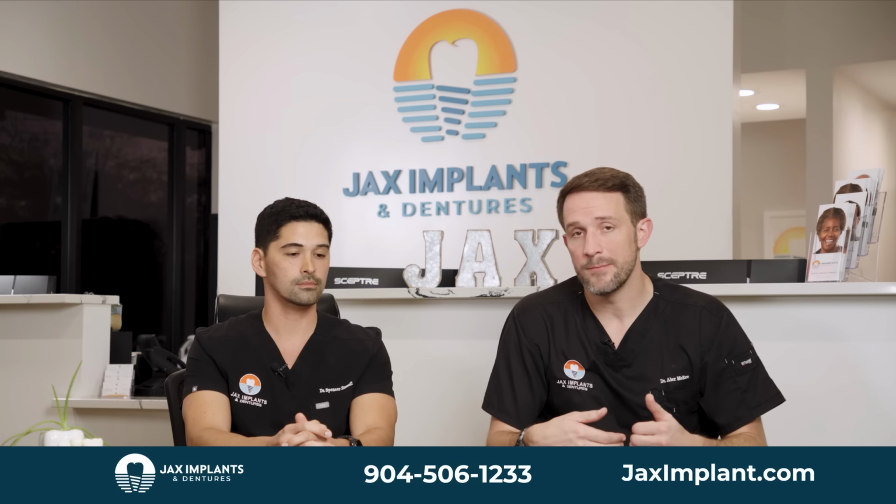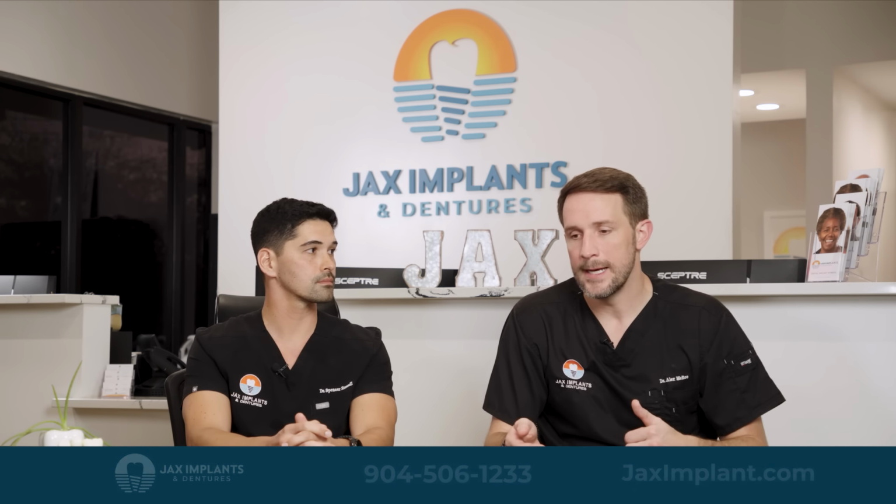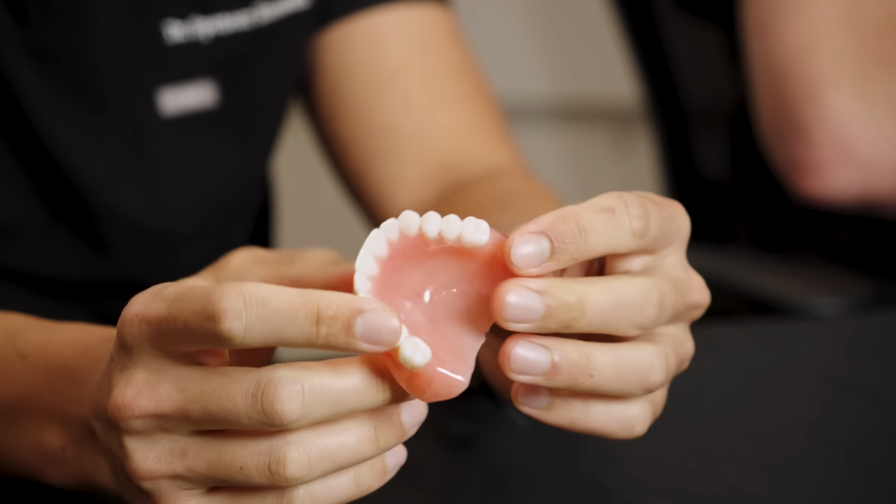If it were my mouth and I'm spending around that kind of money, I'm gonna do this 10 times out of 10. Then our last option here is just going to be your traditional denture. And so this isn't anything that's supported by implants. As you can see here, it's just one piece that's going to be an upper denture.